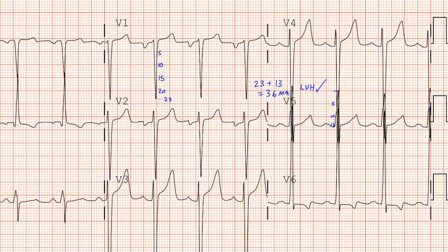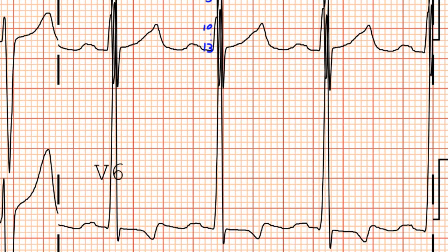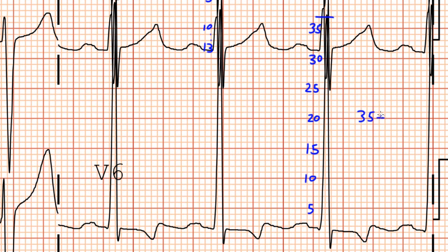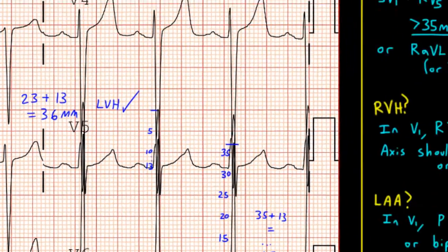You might have noticed that the R waves in lead V6 are significantly taller than in lead V5, so we could also use lead V6 to determine if the patient meets Sokolow-Lyon criteria for LVH. Looking in V6, the R wave is quite tall. In real life, for the purpose of speed, I usually just count off in multiples of 5 unless the voltage is close to LVH. Counting off in gross multiples of 5, we've got about 35 millimeters just in V6, and so 35 plus 13 is definitely more than 35 millimeters — also consistent with LVH.